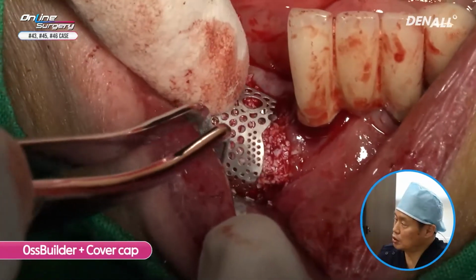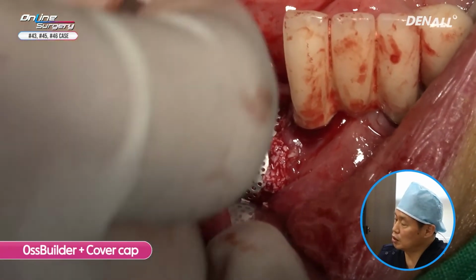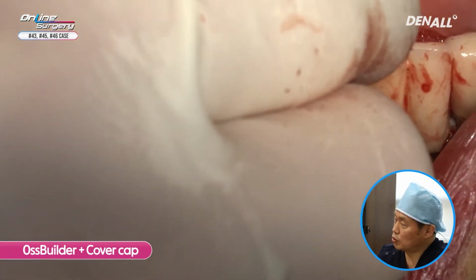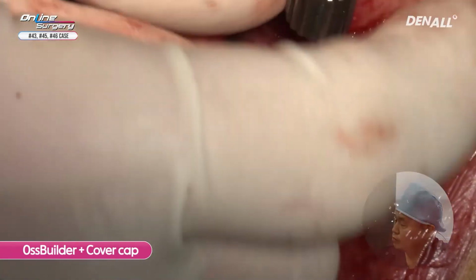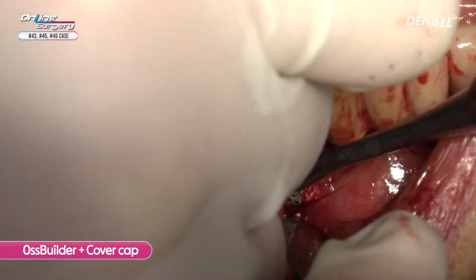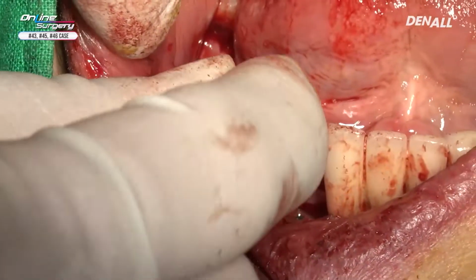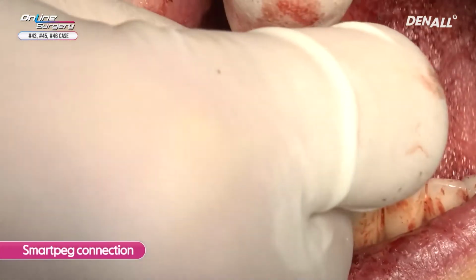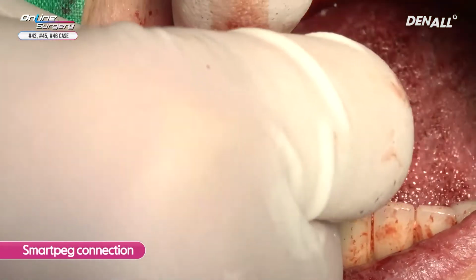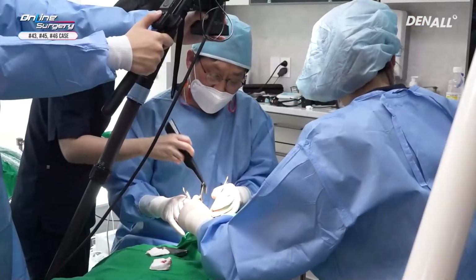As you can see, the OssBuilder, I'm going to trim a little bit because it interferes with the tooth in the front. The OssBuilder cover cap is going to be used and fixed. All done. Suture is going to be done.